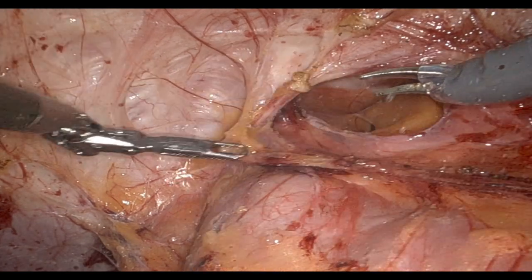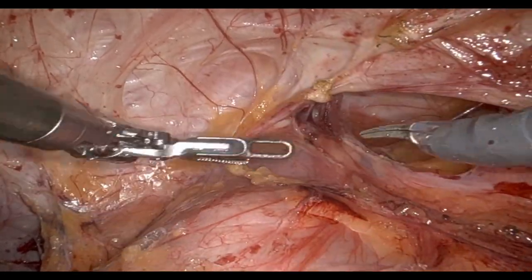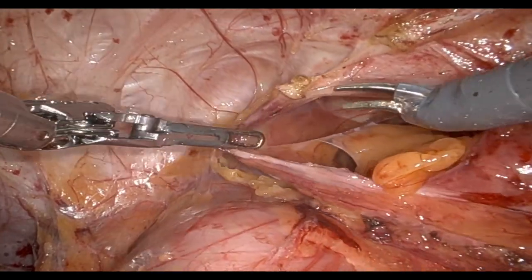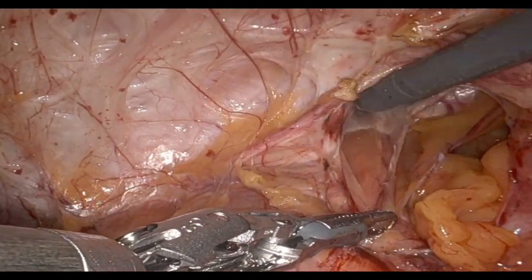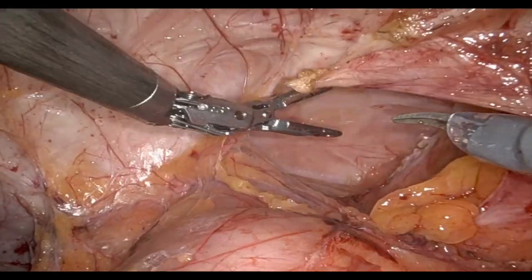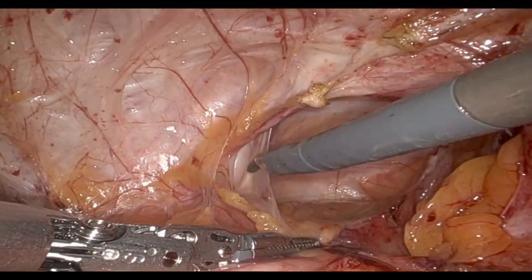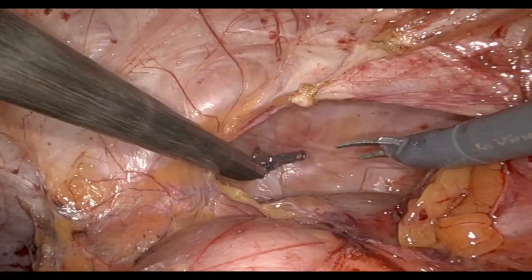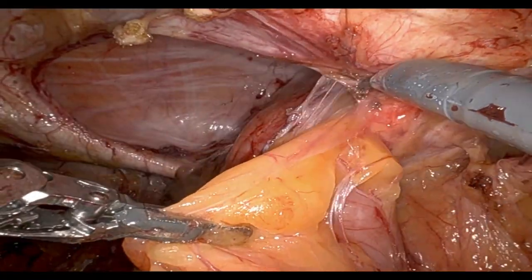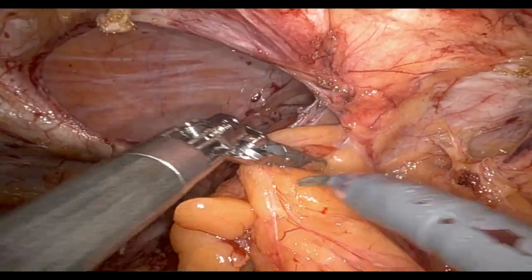Lysis of adhesions in this case took about two hours, with dense adhesions all across the midline and lower abdomen. After about 30-40 minutes of dissection, we finally began to see the rim of the second hernia within the hernia. Fortunately, the adhesions at that point were nice and easy to take down, and we carefully dissected the incarcerated colon away from the sac. You can see us pulling on an epiploic appendage here and reducing the colon.